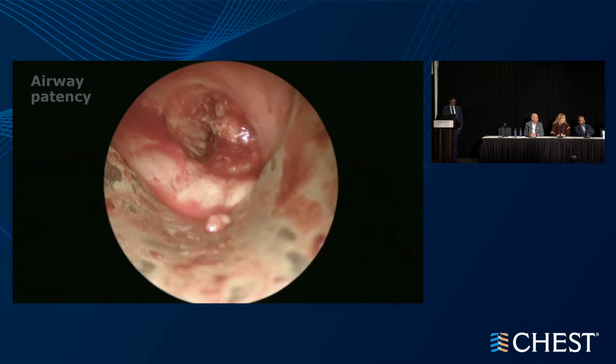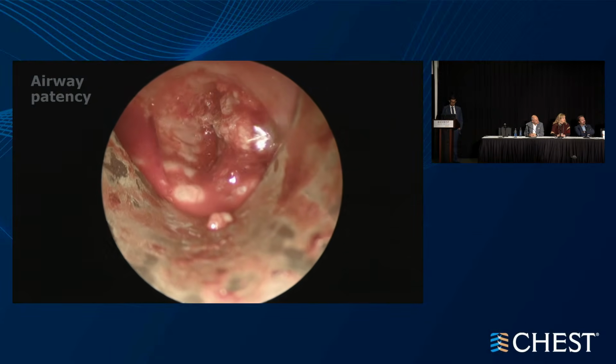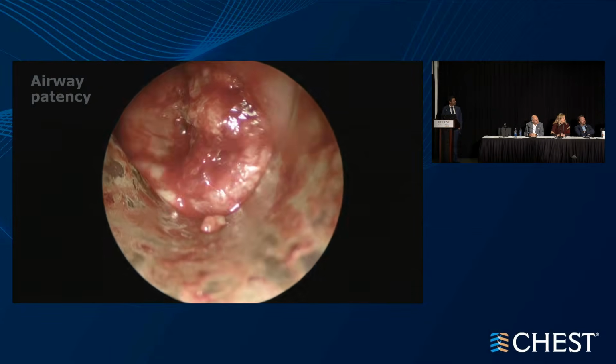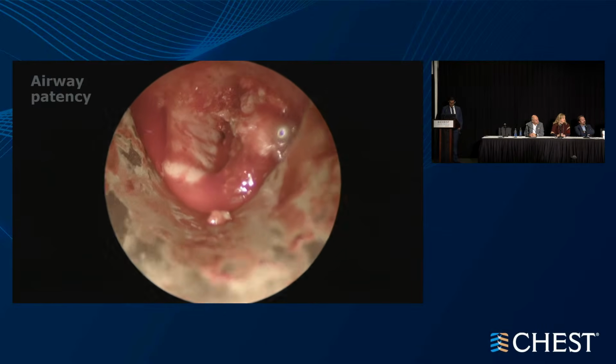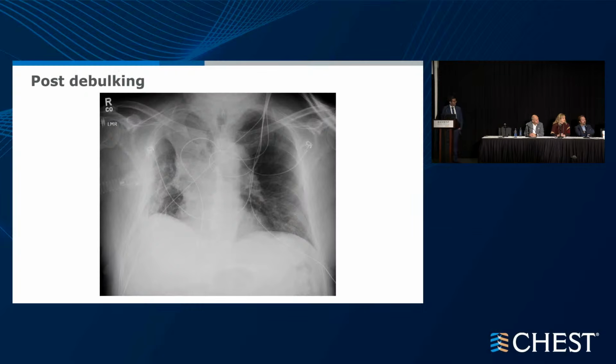And then towards the end of the case, we did clean up a little bit after this, but you can start seeing bubbling behind there. So we've opened up to some degree an airway, and we were able to get decent volumes in there. So I cleaned up a little bit more, dilated a little bit more, and got out of Dodge, and this is where we ended up, post.